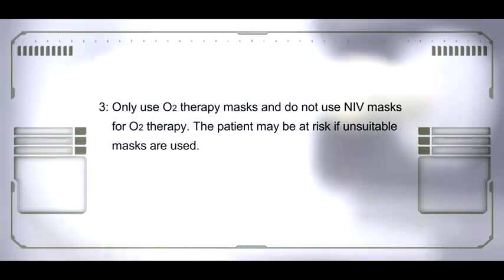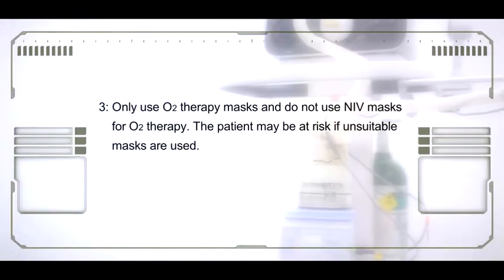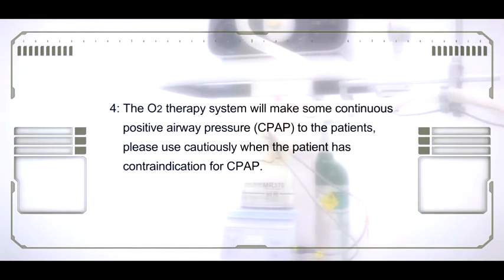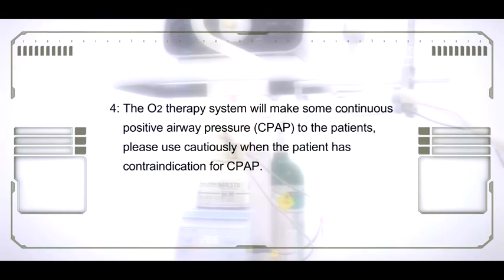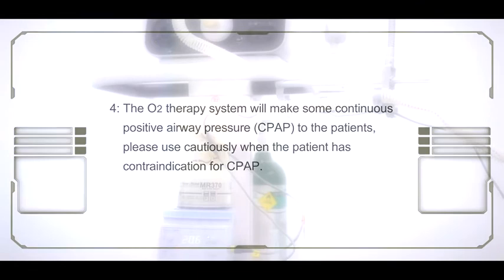Only use O2 therapy masks and do not use NIV masks for O2 therapy. The patient may be at risk if unsuitable masks are used. The O2 therapy system will apply some continuous positive airway pressure, CPAP, to the patients. Please use cautiously when the patient has contraindication for CPAP.